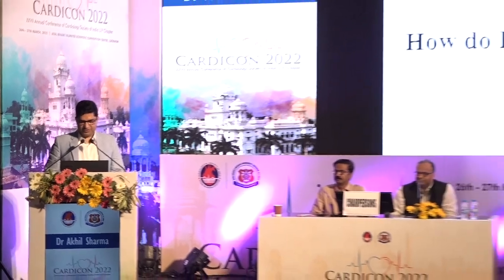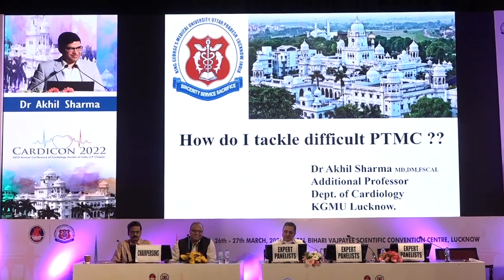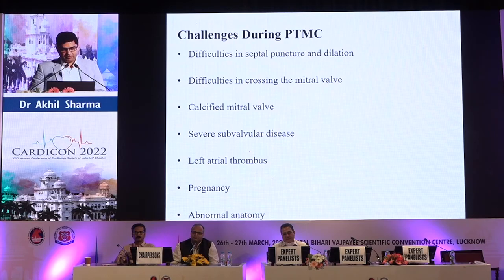Today I am going to talk about how I tackle difficult PTMC in front of my legend master, Professor S.K. Dwivedi. It is always a pleasure to discuss PTMC with Professor Dwivedi. We all know that PTMC is the procedure of choice for isolated rheumatic mitral stenosis. But when we start the procedure, we can face challenges starting from the puncture site, the septal puncture, crossing the balloon to the LV, and after that the particular anatomical substrate. So I will discuss all these in a few slides.